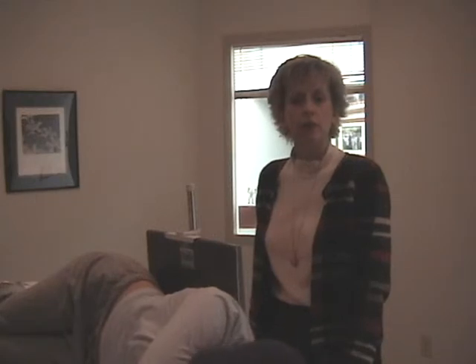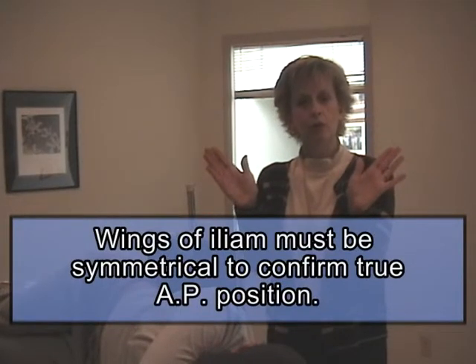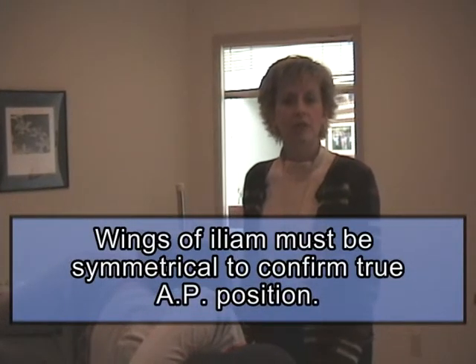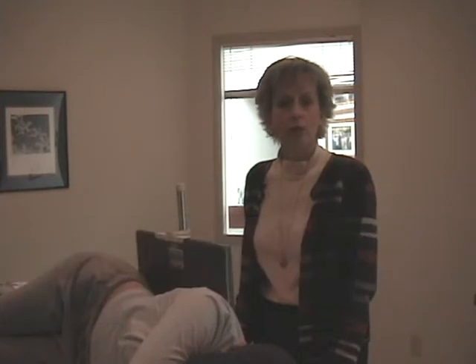You gave the patient breathing instructions for expiration to raise the diaphragm. And again, anytime you're looking at an abdomen, you look at the wings of the ilium to make sure they're symmetrical in order to know that you were a truly AP position or not. If one wing is wider than the other, that one was the side closest to the film.